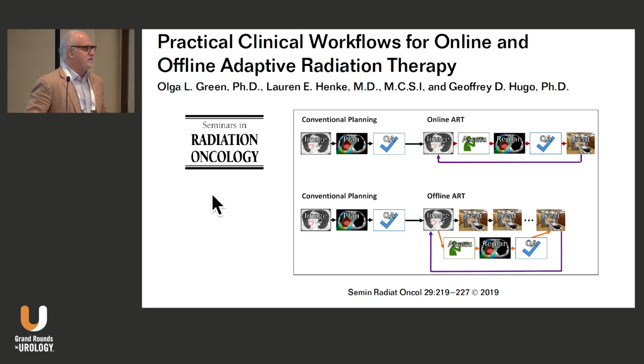So you can see right off the top, the online is the real challenge. That's the one that certainly today, and I'll talk about what is in use today, is extremely time consuming because you're continuously replanning based on what you're seeing. And the question, I'll bring it up now as we go through the slides, the real question is, is prostate the best site to really be testing this? And is it something that we really need in prostate cancer treatment?